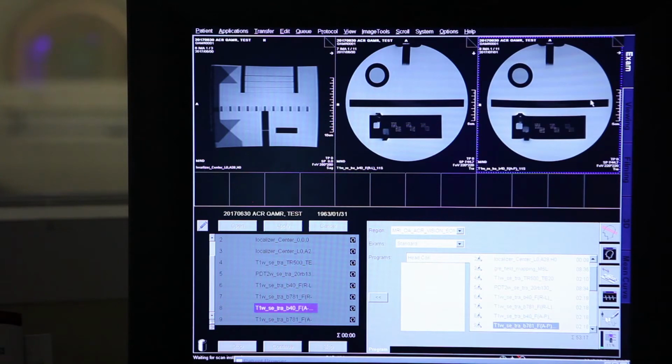Yes, there is a problem. It looks like we have a problem. So, Houston, better a problem we found out why. So it's there, and then you can pinpoint it. We're going to do the same thing in the z-axis, so you're going to see if that persists. So we already have an outcome of our QA test, live, on camera.